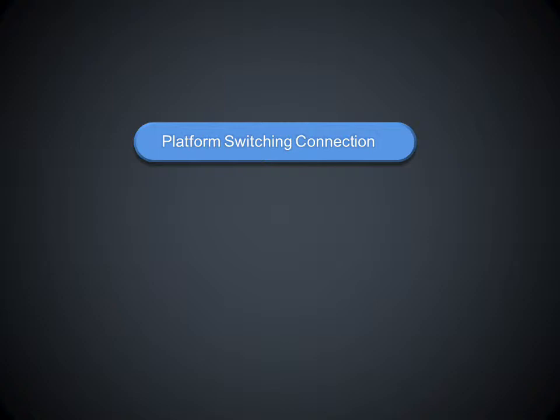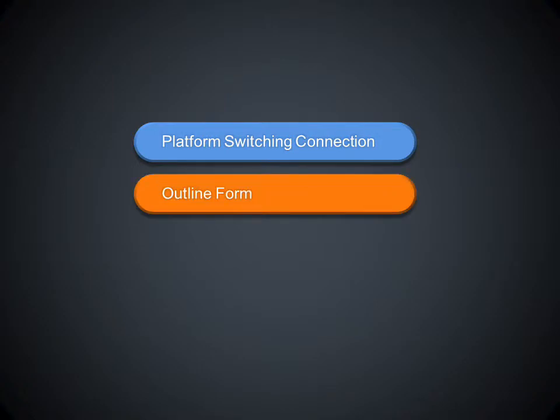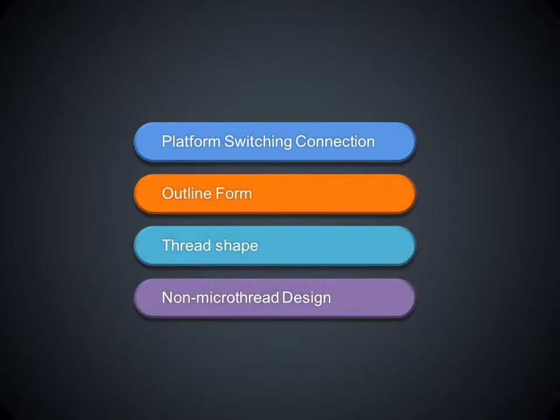Introduction of INNO implant fixture design. Platform switching connection. Outline form. Thread shape. Non-microthread design.